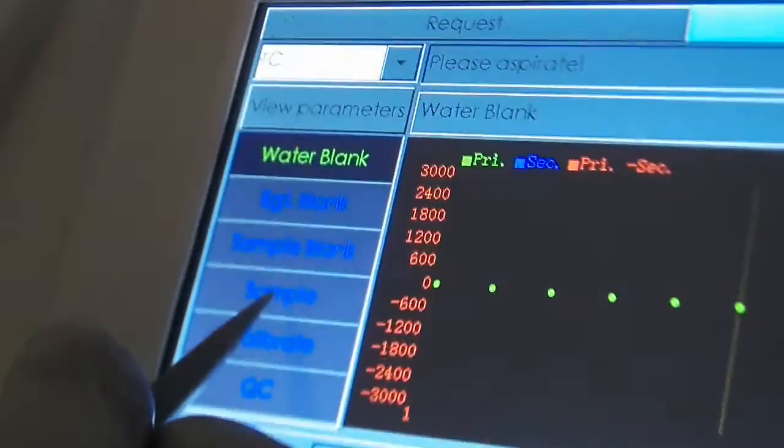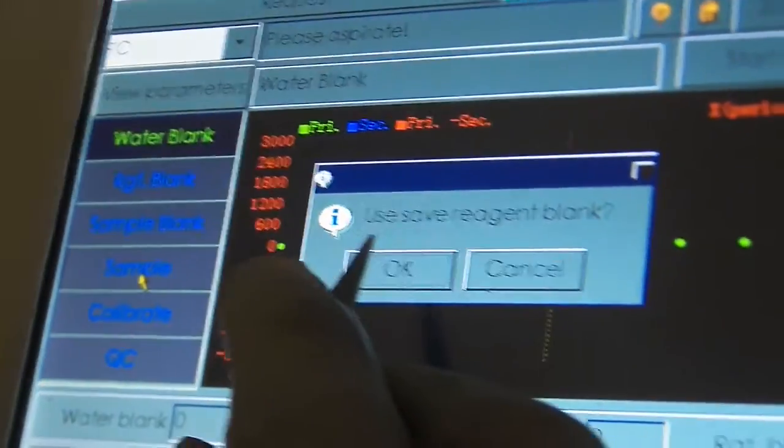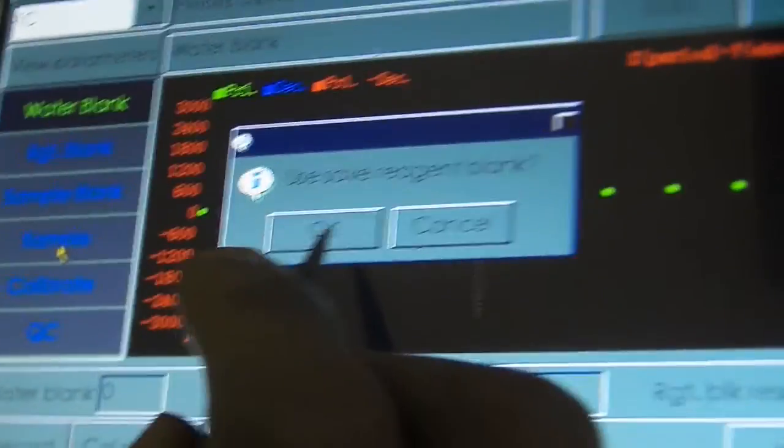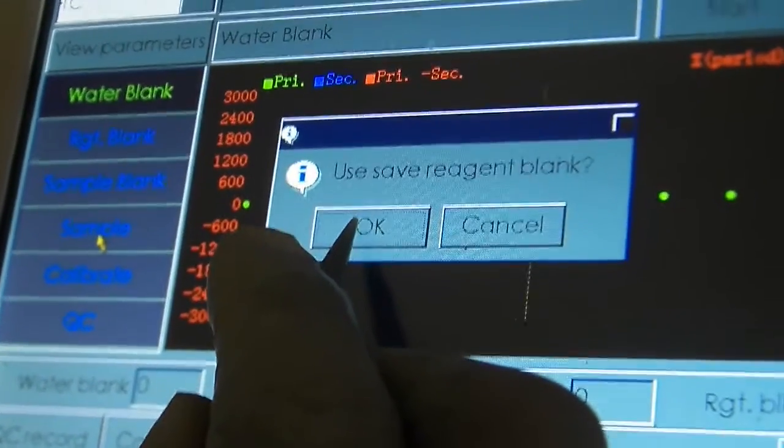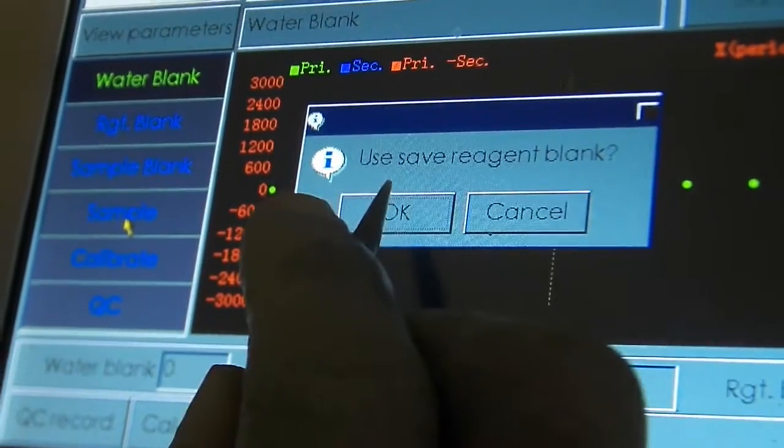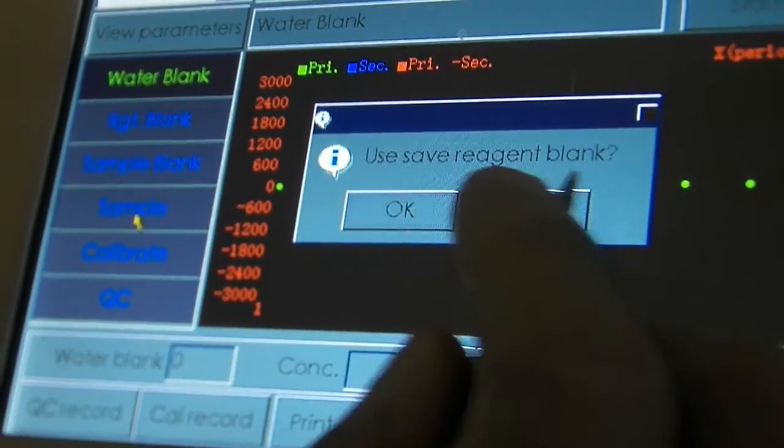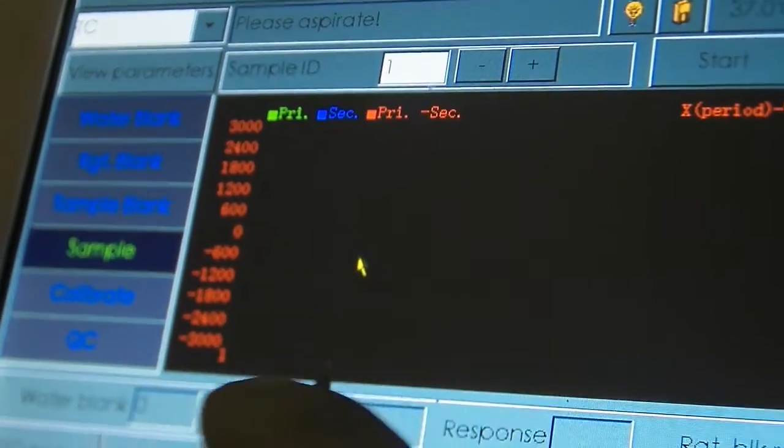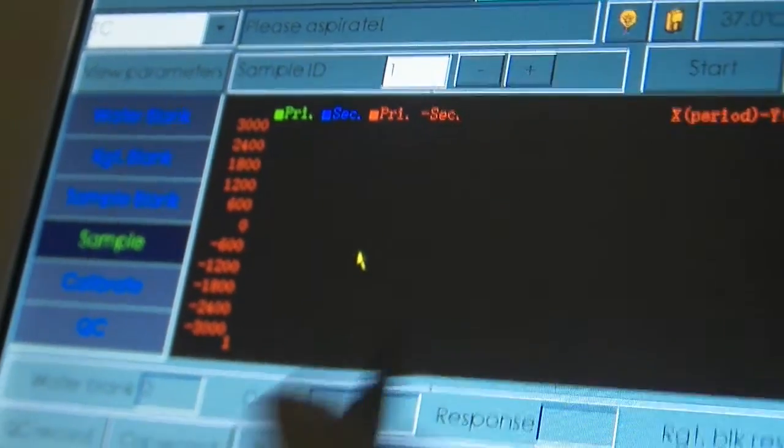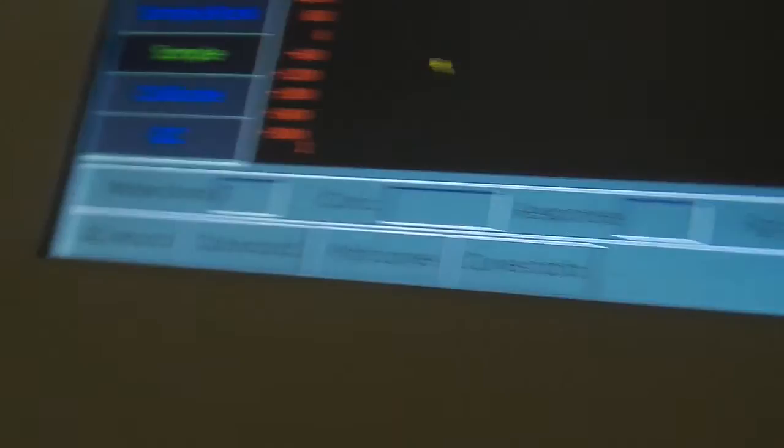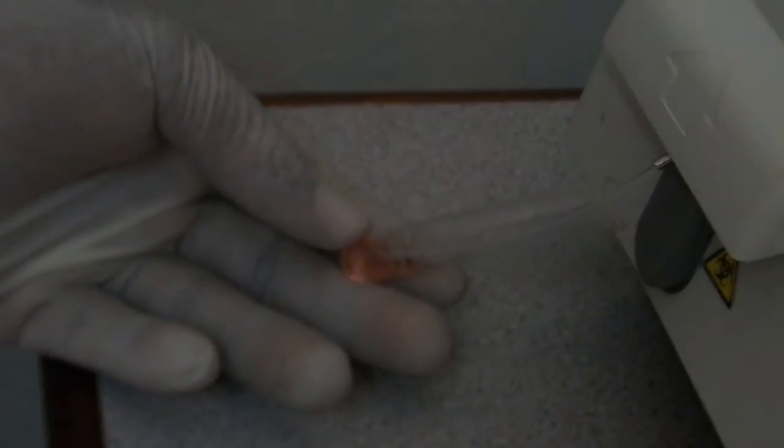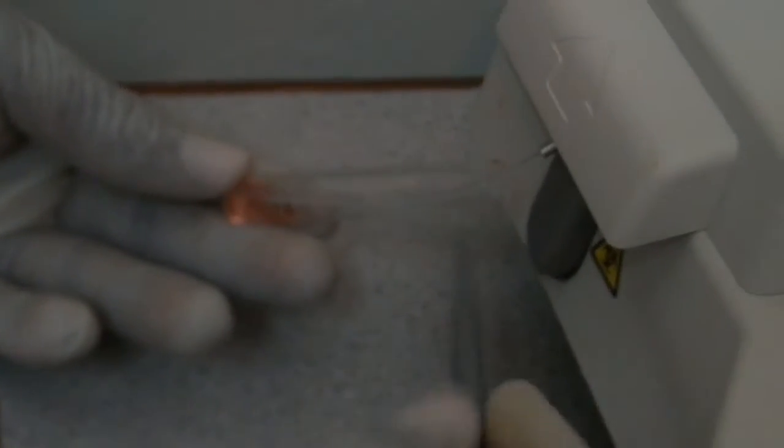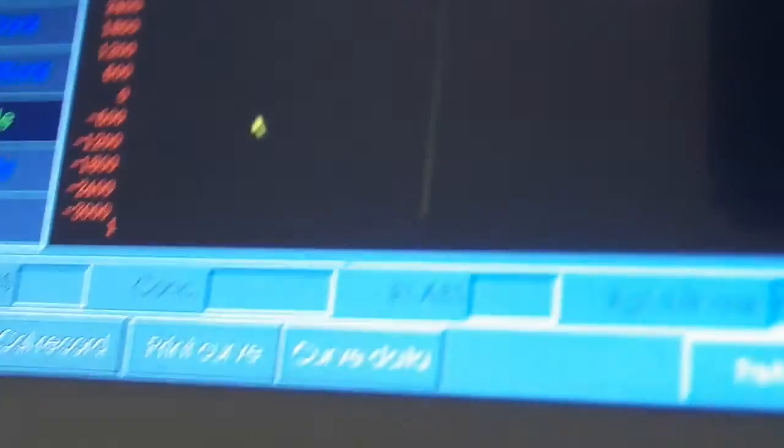So you click on sample. You go to use self reagent blank. You say okay. And you're ready to test. So get the probe right in there. And click for the test.